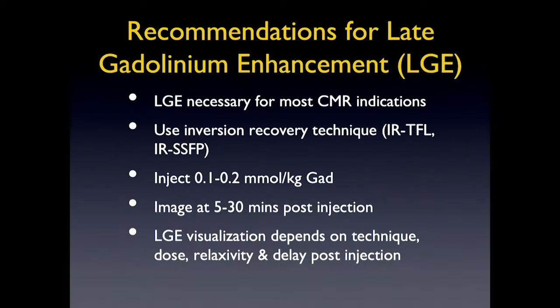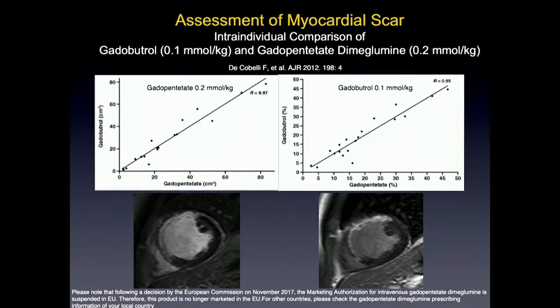So I'm going to allude and talk a little bit about some of these studies which try to address when to image the heart post-gadolinium injection and when late gadolinium enhancement should be imaged. So if you look at some older studies, here's a study comparing single-dose gadobutrol to double-dose gadopentetate, where they measured scar with both techniques.